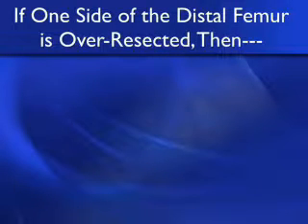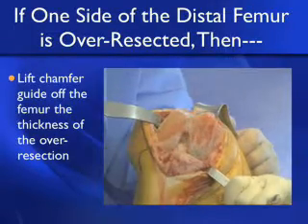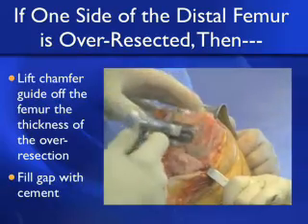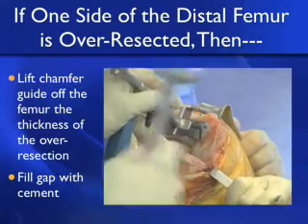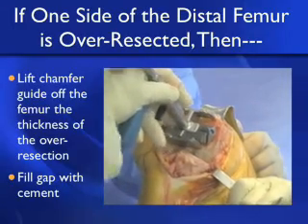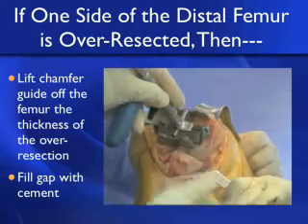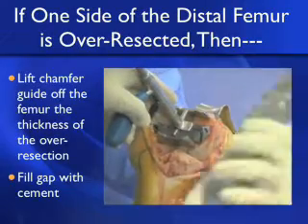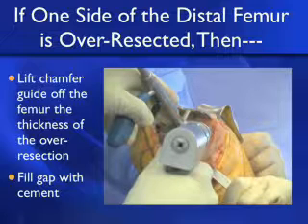You can correct intraoperatively if one side of the distal femur is over-resected. Simply lift the chamfer guide off the femur by the thickness of the over-resection, and later fill this in with bone cement. For demonstration, if we took away 2 millimeters more bone than intended medially, we simply readjust the position of the medial side so it's 2 millimeters off the distal cut, pin it in that location, and fill this gap with cement.